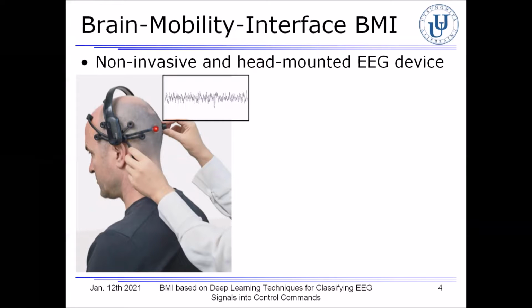The brain wave frequency of the measured EEG signal varies in accordance with the concentrated and relaxed states. So we focus on the following two types of EEG signals: when the user concentrates and relaxes, and faces to the right, left, and front. For the input EEG signals, the brain state and face direction are estimated by the classifiers.